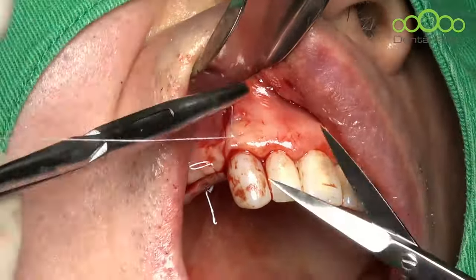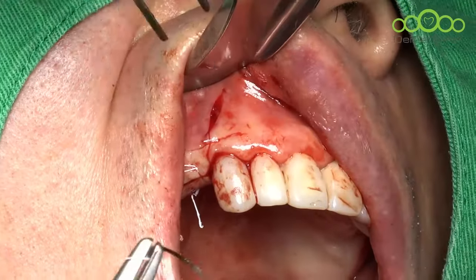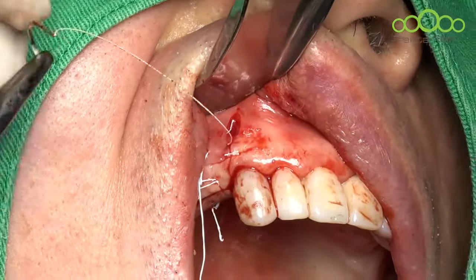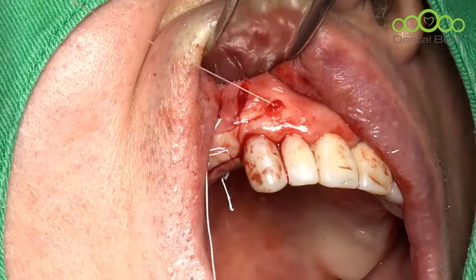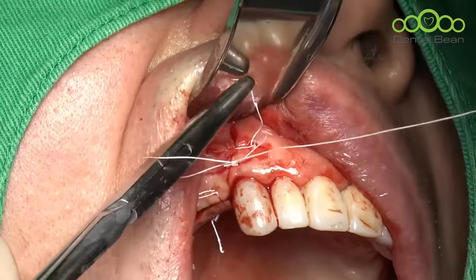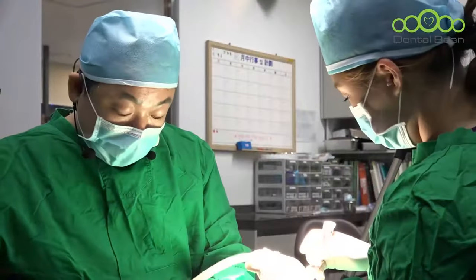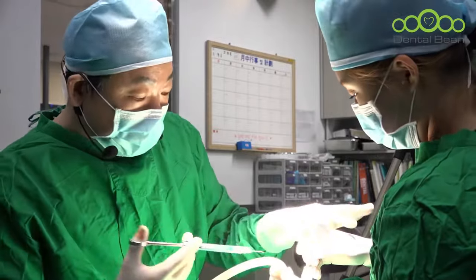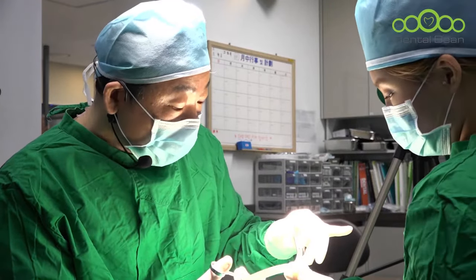To avoid this, I recommend a long vertical osteotomy if you make the vertical osteotomy. However, Dr. Sir suggested no vertical osteotomy to prevent such accidents. If you don't make a vertical osteotomy, there's less chance of buccal plate fracture. However, the disadvantage is that we cannot separate the ridge effectively. There's less width gain. So if you focus on the safety of the buccal plate and the stability of the implant, we can omit the vertical osteotomy. But if you focus on ridge width gaining, we can do classical splitting or follow my method.